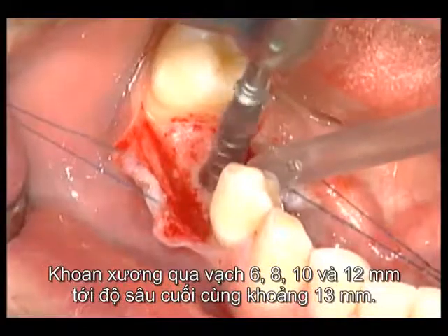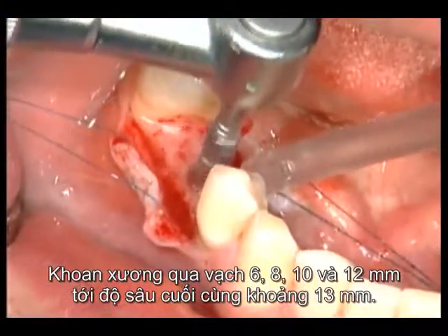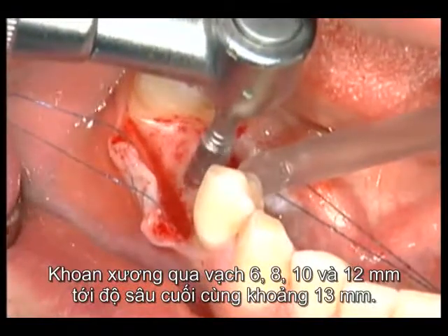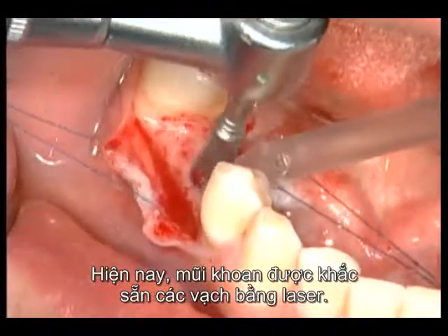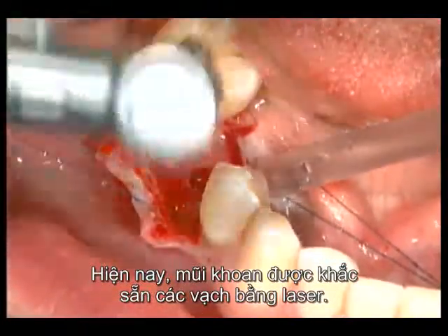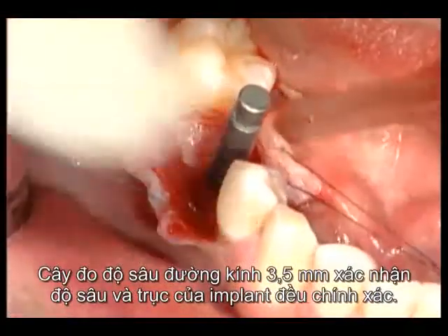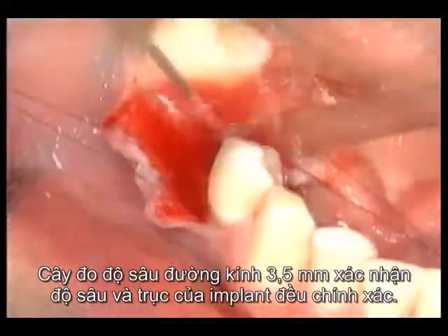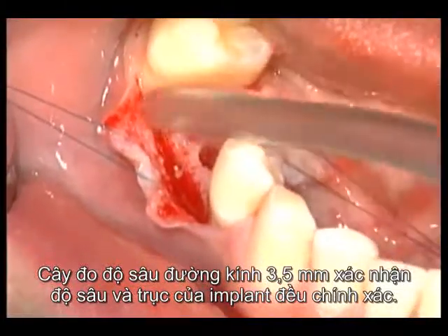The bone preparation passes the 6, 8, 10, and 12 millimeter lines to the final sink depth of approximately 13 millimeters. Today, these drills are provided with laser rings. The depth gauge with 3.5 millimeter diameter confirms the correct sink depth and the implant axis.